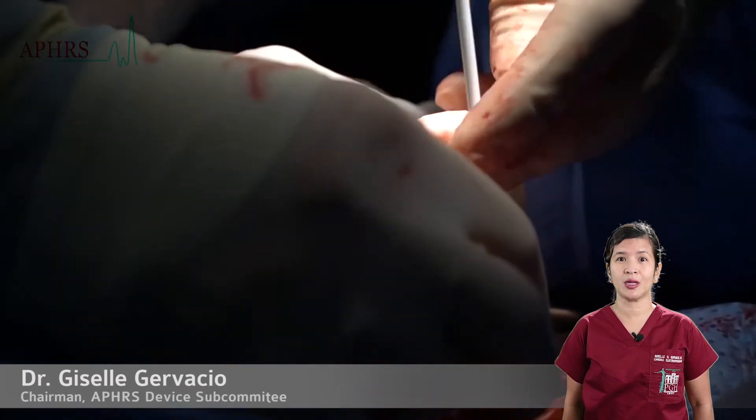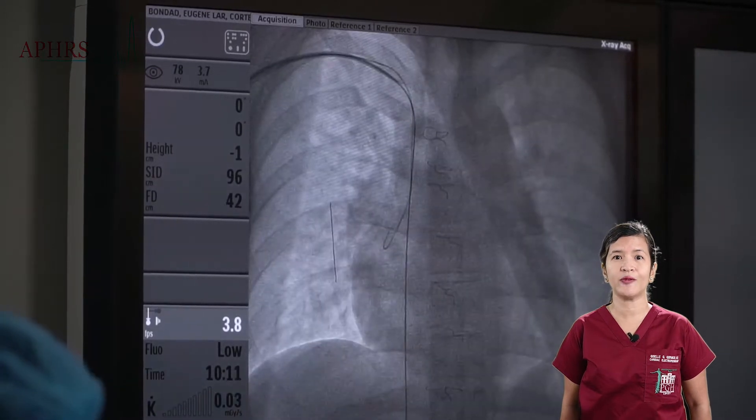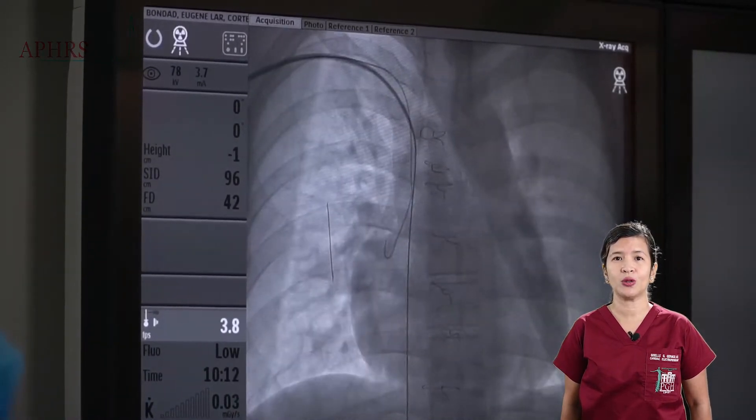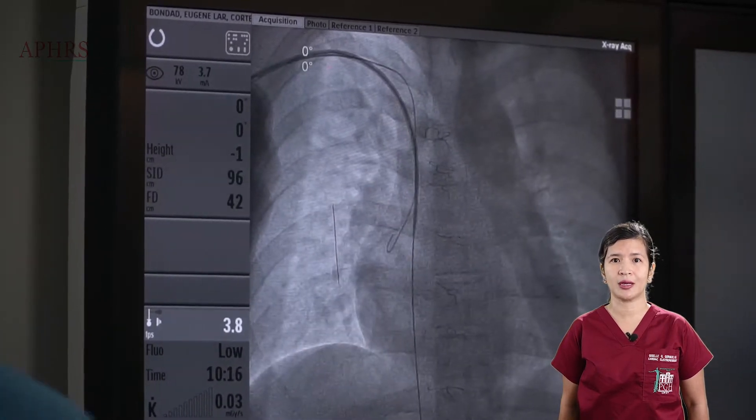The peel-away sheath is inserted over the guide wire, with the guide wire positioned in the inferior vena cava. This is done under fluoroscopy to ensure that no part of the vein or heart wall is snagged.